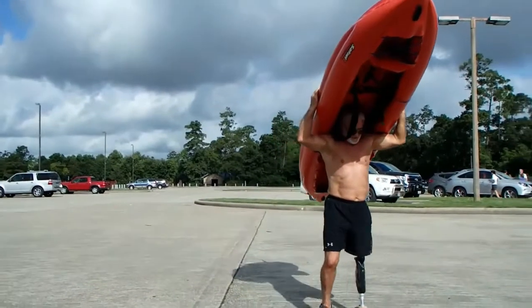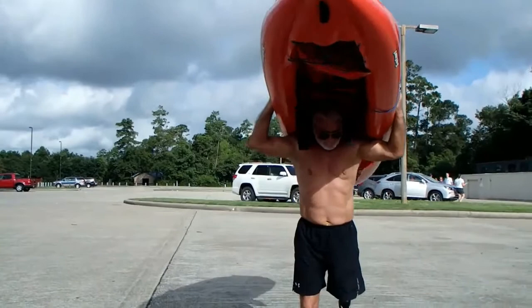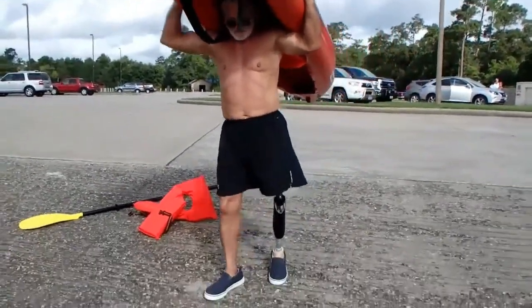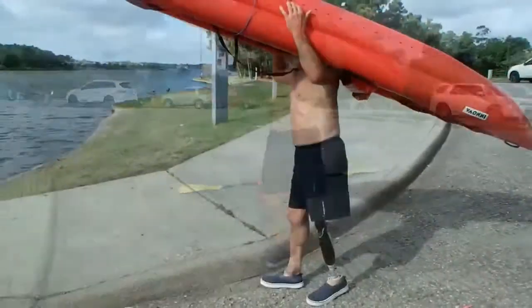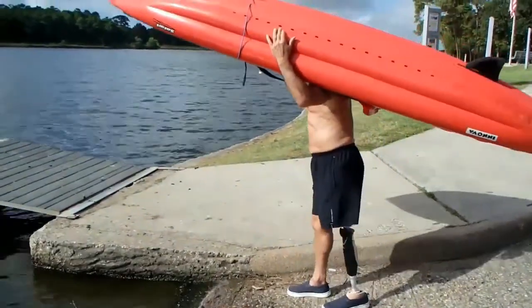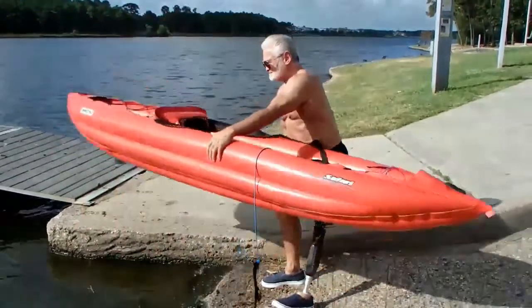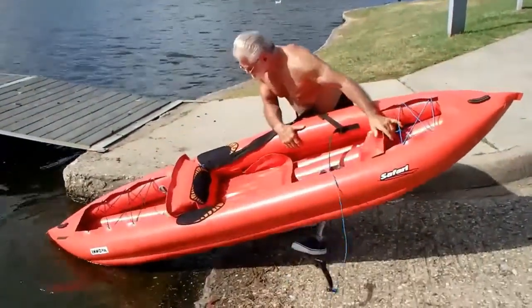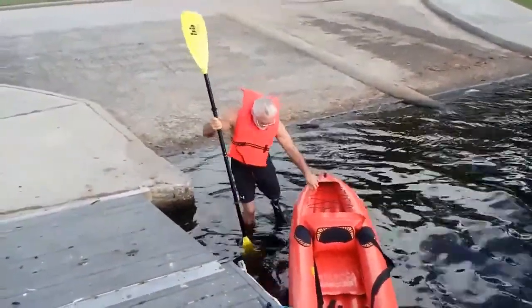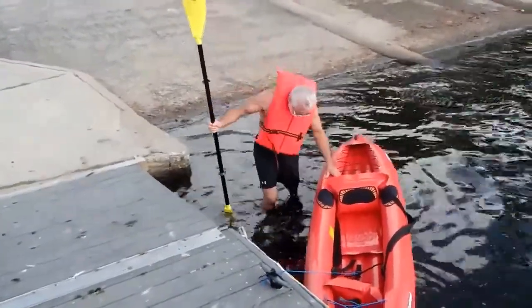I think this is an example of something going beyond and out of the box. He has made a fluid intelligent, much in the same way as they make electronics intelligent. And remember, electronics, how does that work? With zeros and ones, that's on and off switches happening constantly to make it have its intelligence. In this situation, he's used fluids to be the driving force in the control of speed and resistance. And hopefully you'll understand this by the time we reach the end of this presentation.